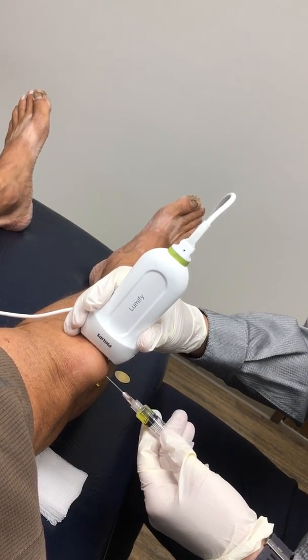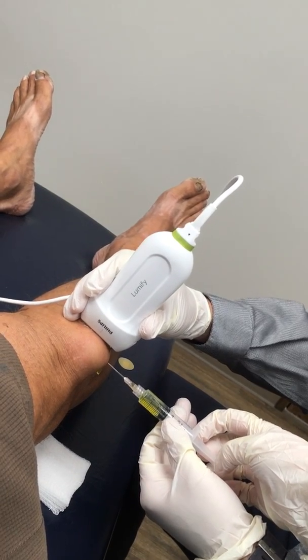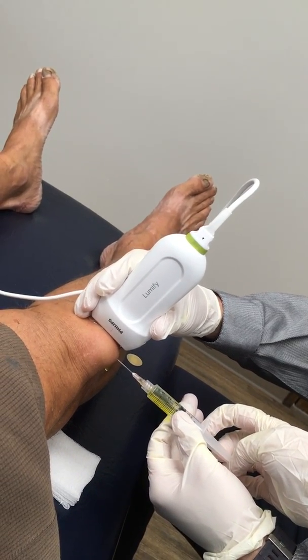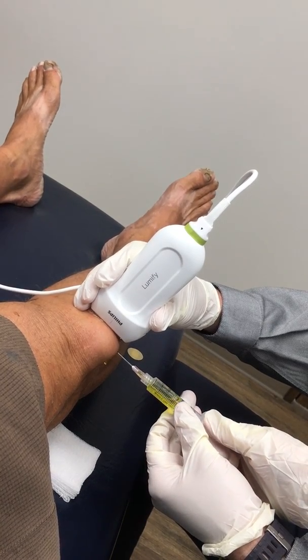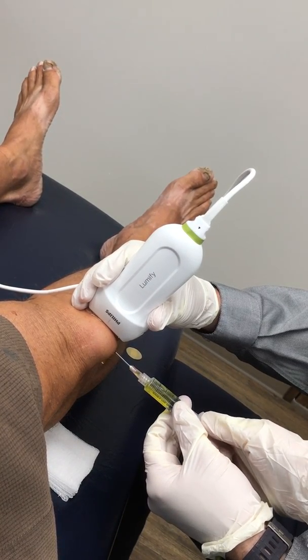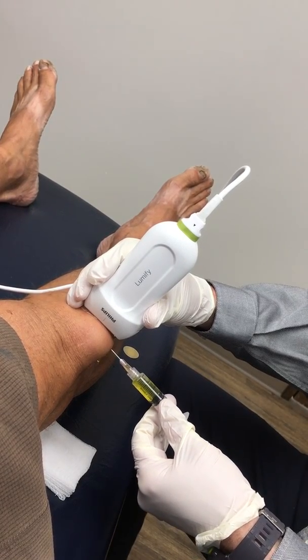Great, and then it's already kind of auto-filling. You can just see there's that much pressure. Larissa's going to help here. And again, it's kind of nice. I can use guidance of ultrasound as I go in. These are usually quite difficult to aspirate. So she's trying. I'm going to maybe reposition and go to a different part of the cyst.